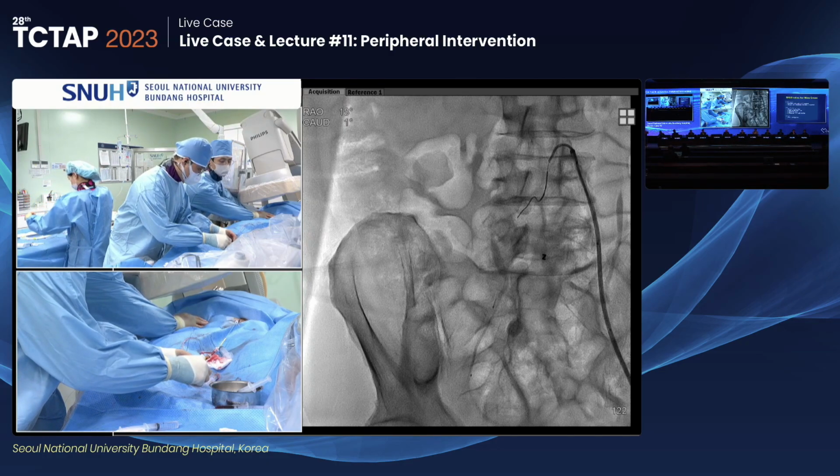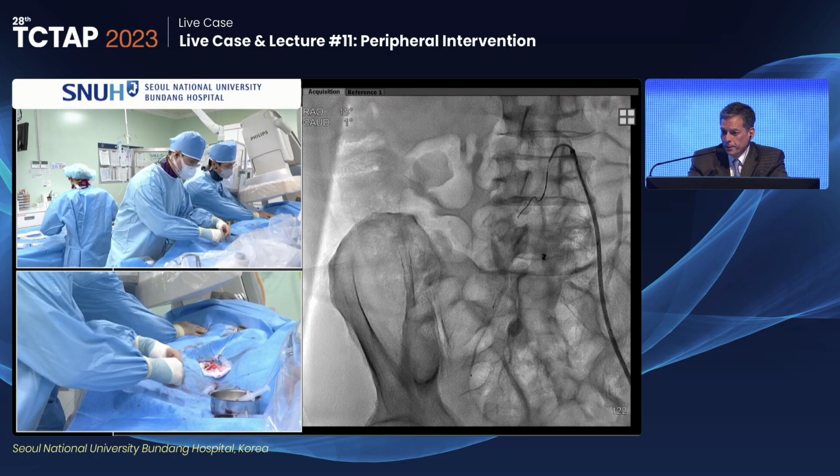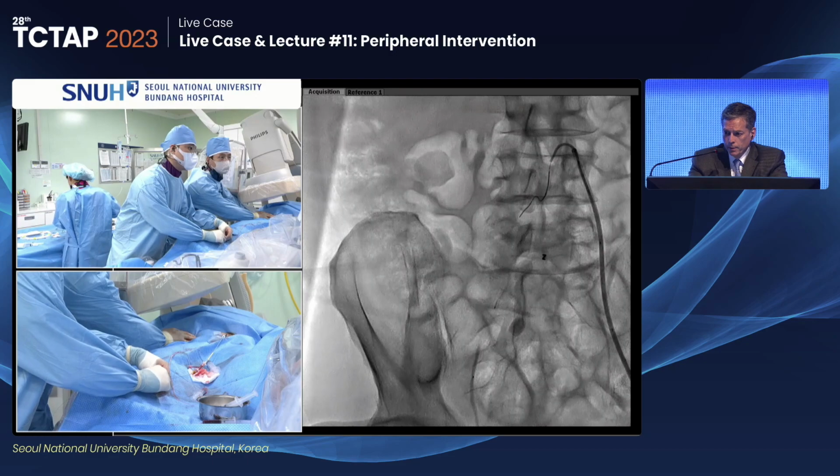As much as this is a challenging case, and it's turning out to be even more so, this is great on-your-feet thinking and a great demonstration of phenomenal technique, with a great cath lab crew working together.